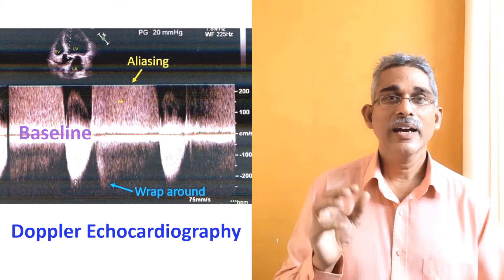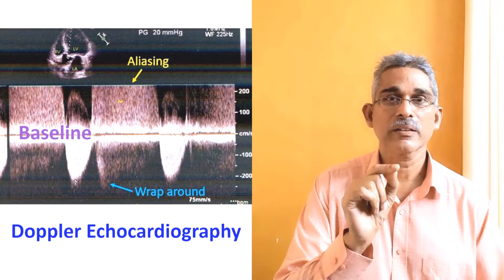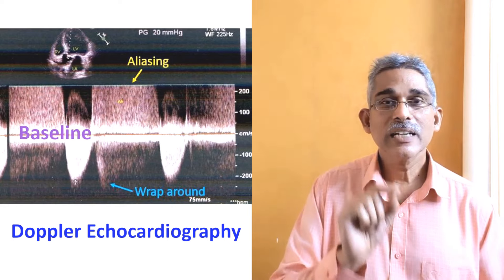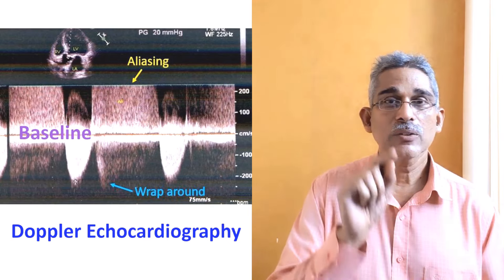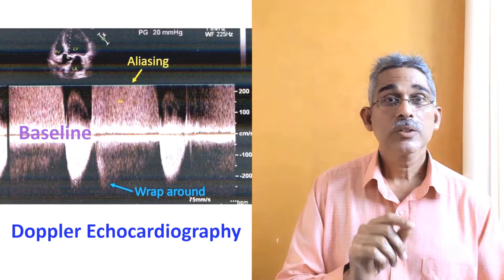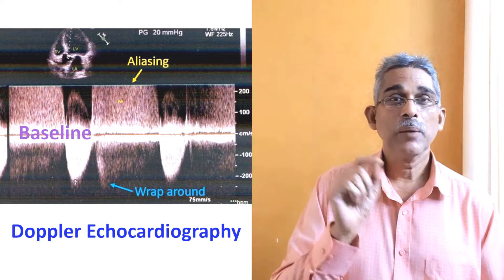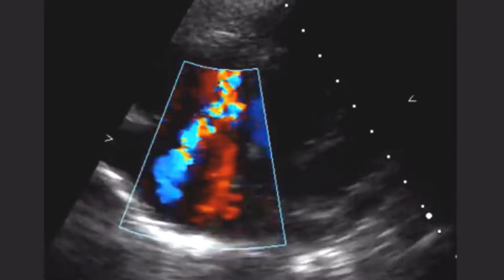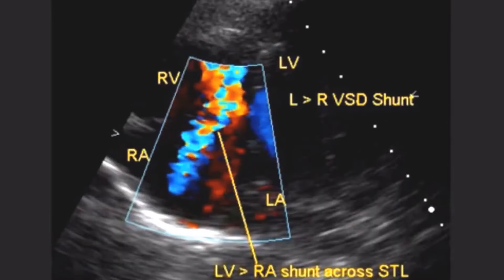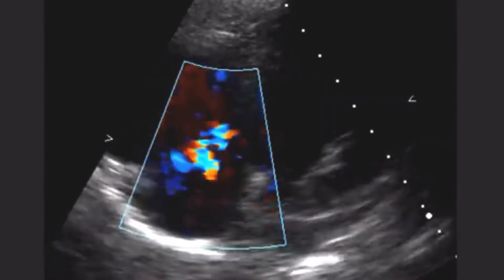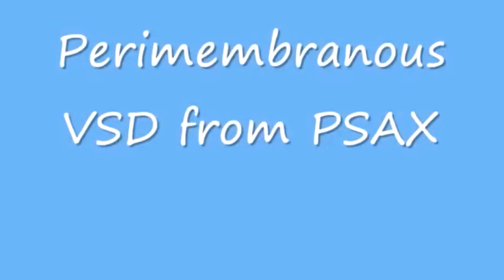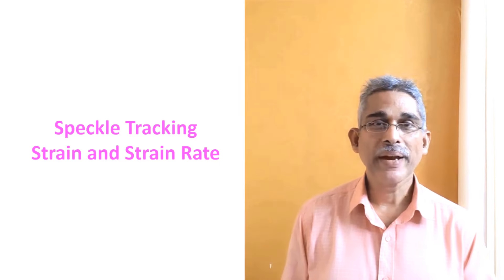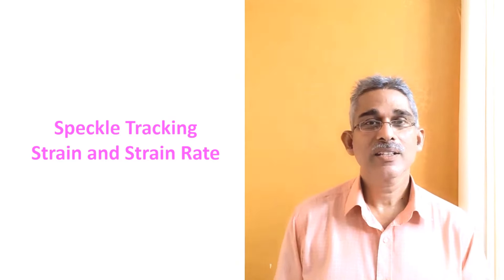The mosaic pattern allows you to easily recognize a jet. For example, a small ventricular septal defect may not be visible on two-dimensional echo, but because the opening is small, the jet from the left ventricle into the right ventricle will have a high velocity, making it easy to detect a small VSD by Doppler rather than by two-dimensional echocardiography. This image shows a left ventricle to right atrial shunt on color Doppler — a rare form of perimembranous VSD with LVRA shunt. More advanced modes like speckle tracking, strain imaging, and strain rate imaging will not be discussed now.